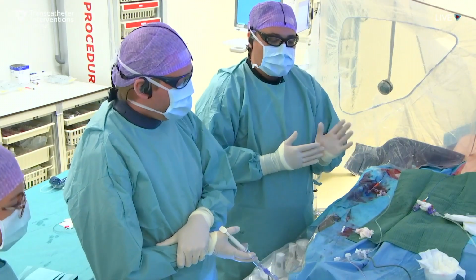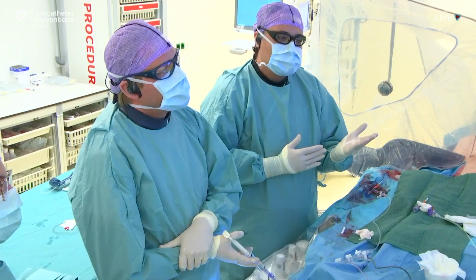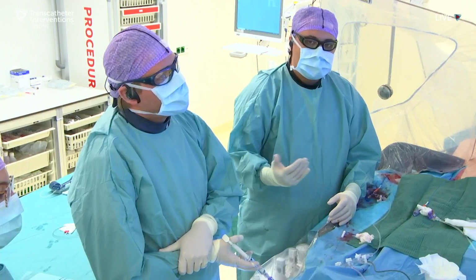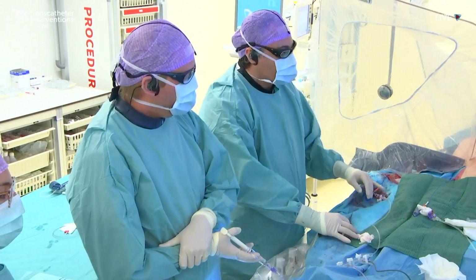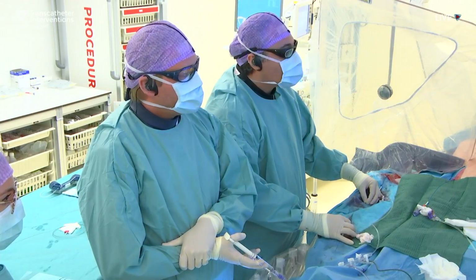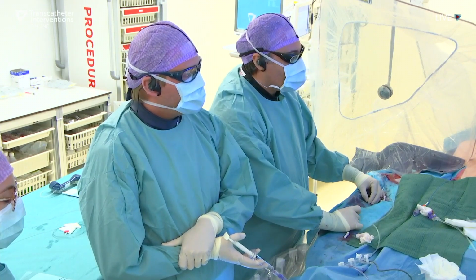So you have to have a good balance between support for the wire and the fact that your wire is extremely floppy, and your guide and your microcatheter can damage the vessel, the epicardial. So let's try to see if this catheter is crossing the epicardials. This catheter, you need to go clockwise.